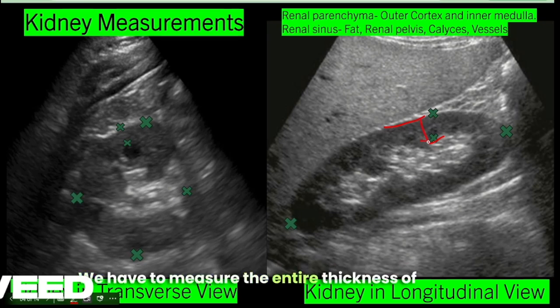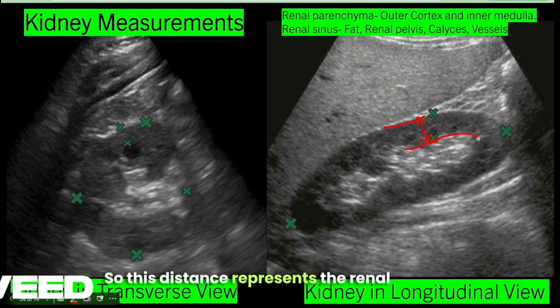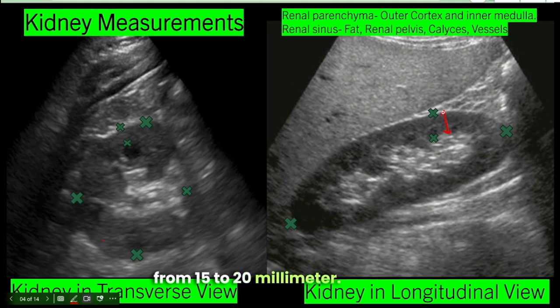We have to measure the entire thickness of the kidney, only leaving central echogenic renal sinus. So this distance represents the renal parenchymal thickness of the kidney. Normal renal parenchymal thickness ranges from 15 to 20 mm.